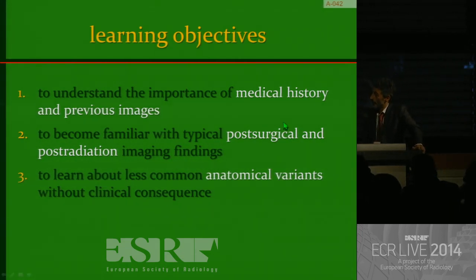So in the absence of books, what you must definitely do is to press your surgeon to give you all the information, because once you know what has been done and what has been repaired, it becomes much easier to understand what is going on and if a relapse is present. And of course, the more anatomical variants you know, the less you will be misled by them.